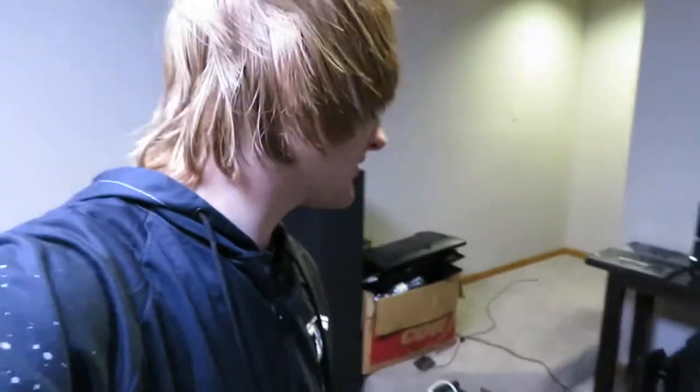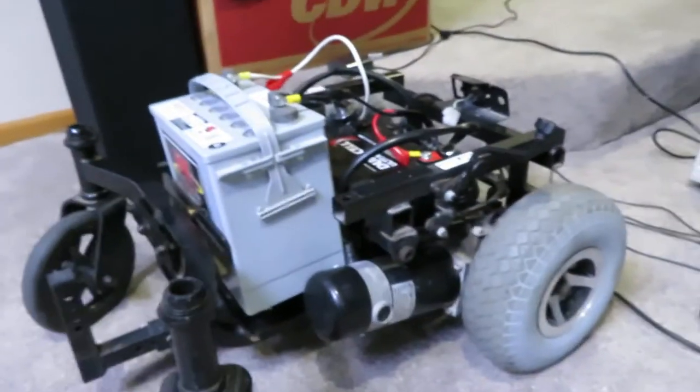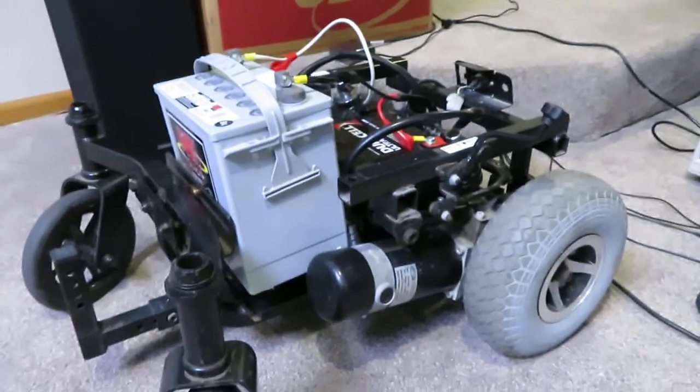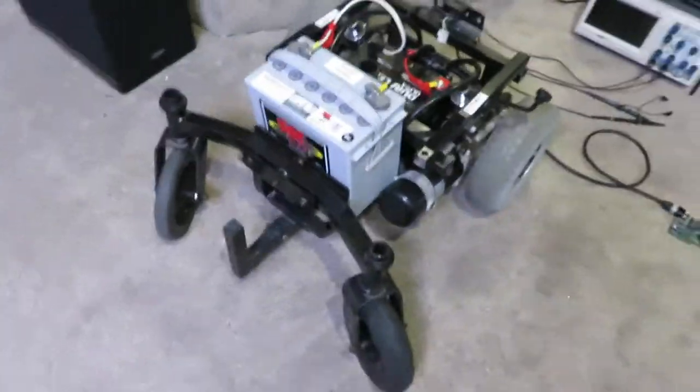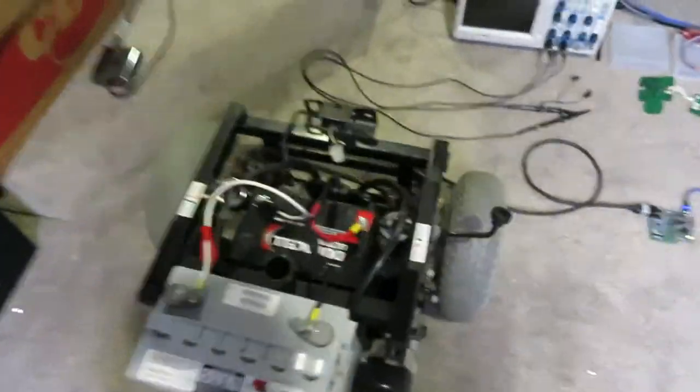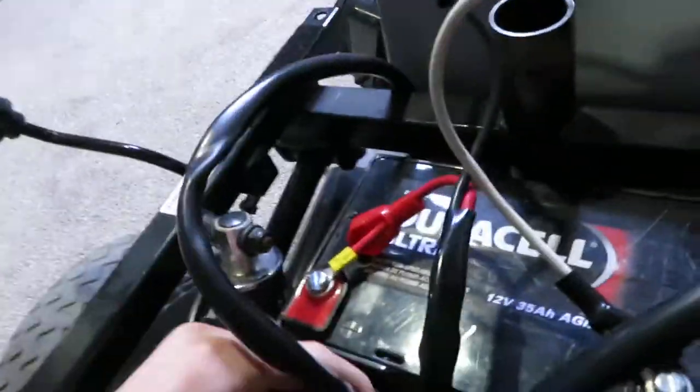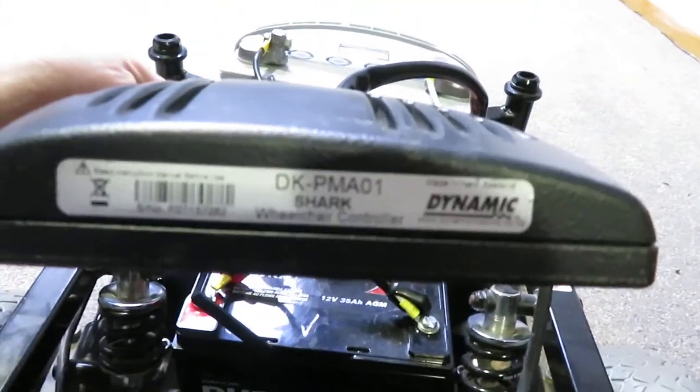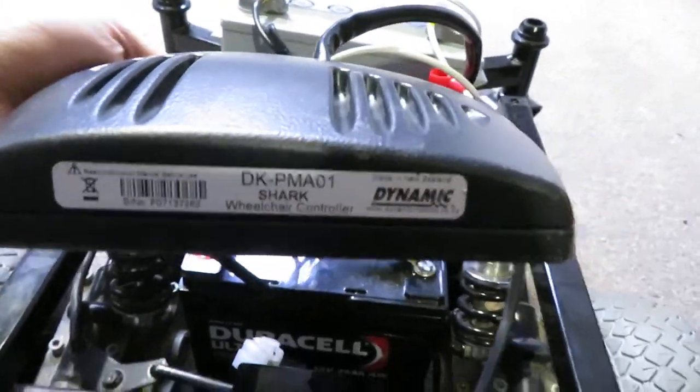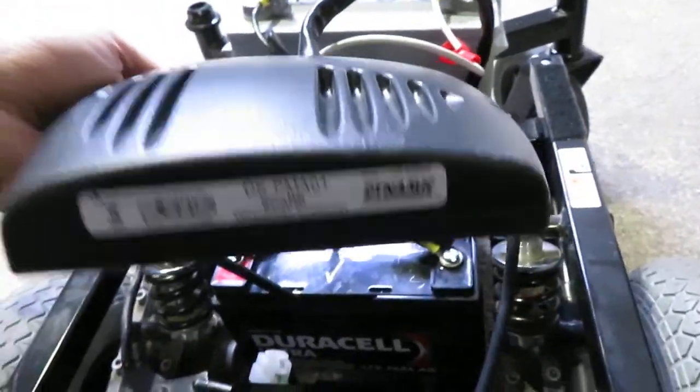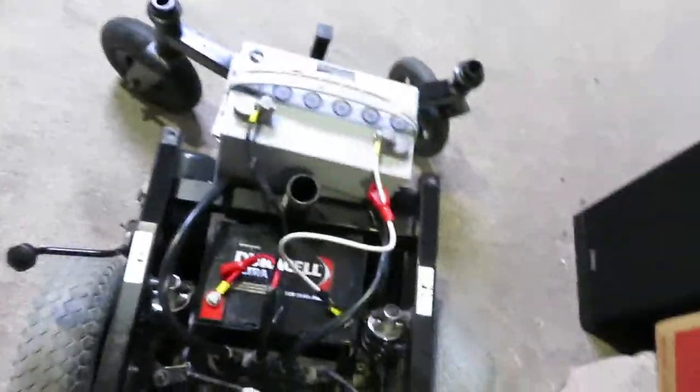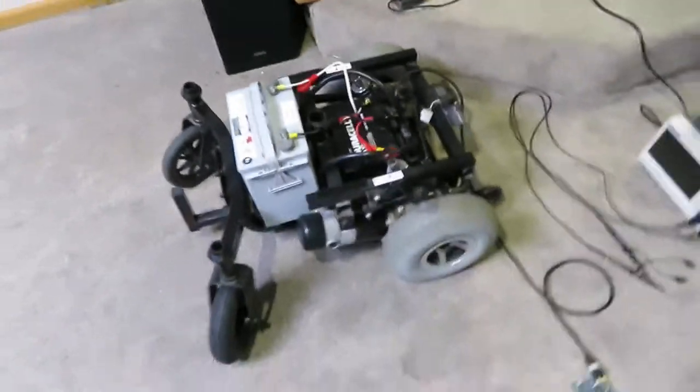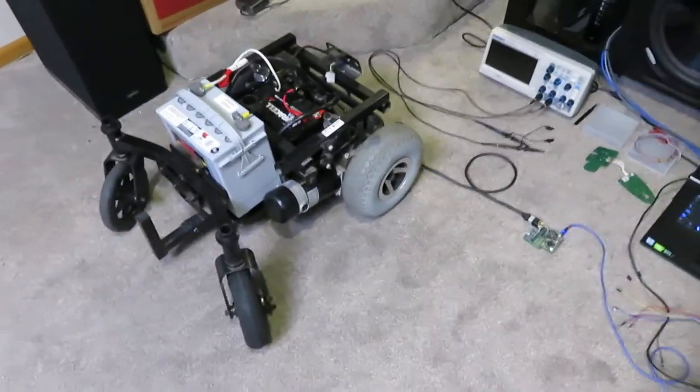I've been working on something pretty sweet the past couple of days, so let me show you. Here we have half of a mobility scooter. This one has a Dynamic Controls Shark controller. Let's see what the exact model is - DK-PMA01. And of course it's controlled by the Shark bus, which I figured out is actually an RS485 bus.